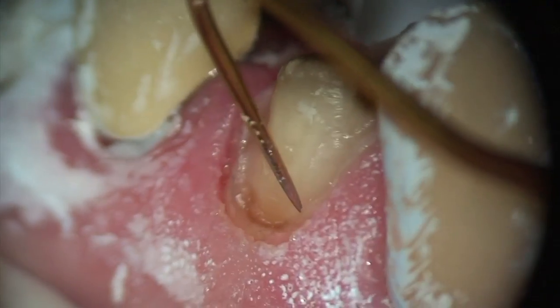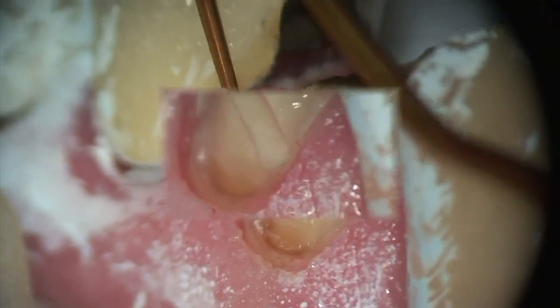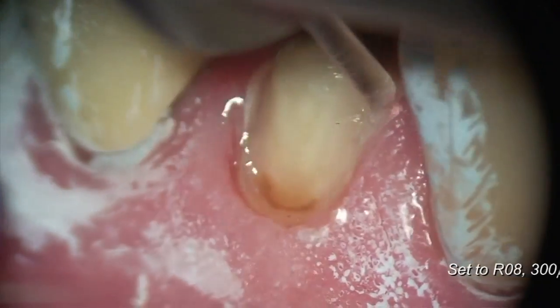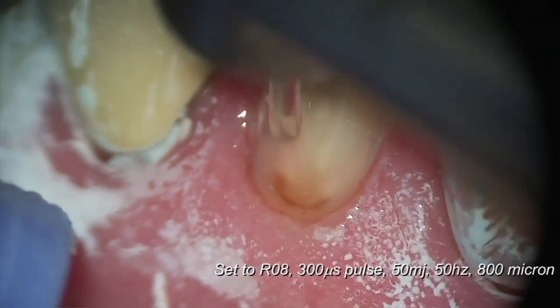After I expose the margin, look — no bleeding. I'm going to find some fault in the preparation here. So you have a couple of choices: one can pull out a diamond and smooth, or in this case, I decided I would just use the laser.